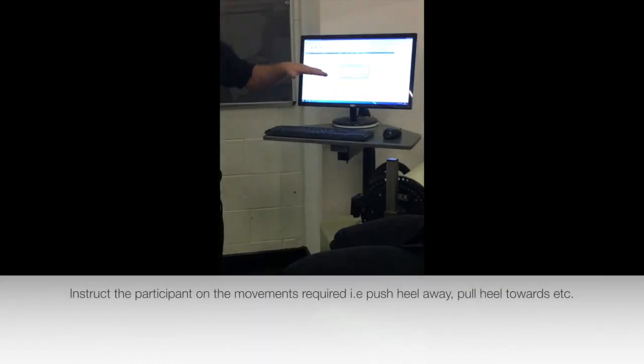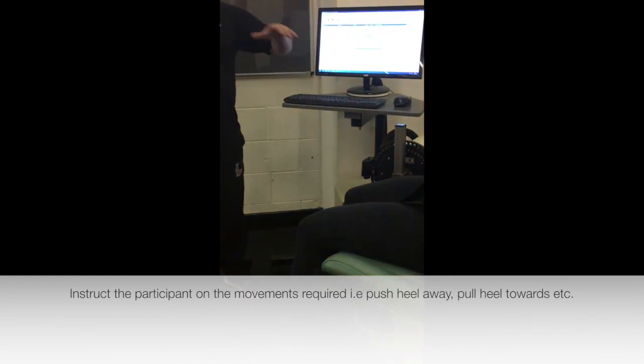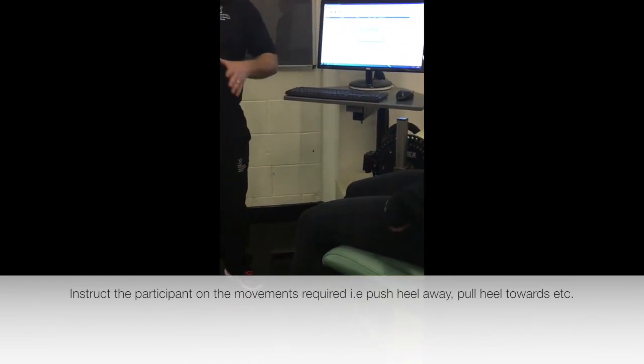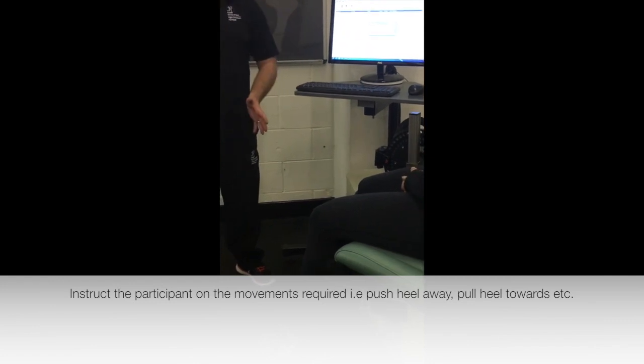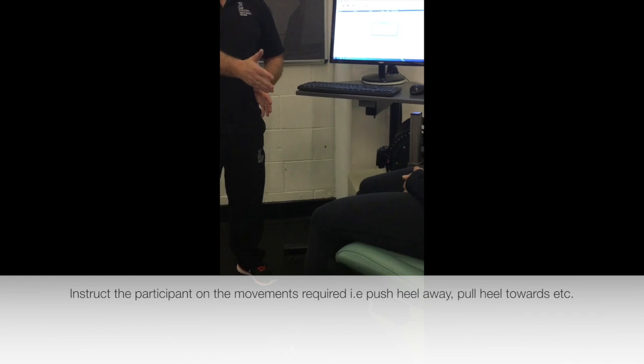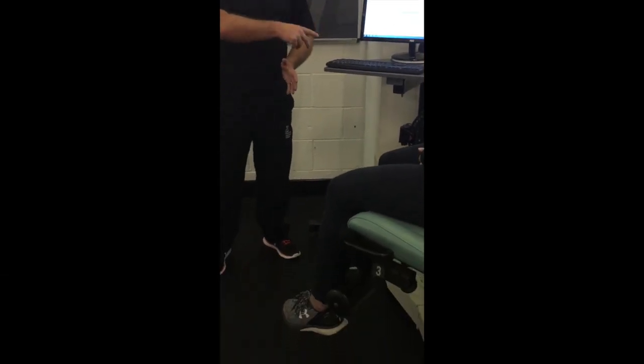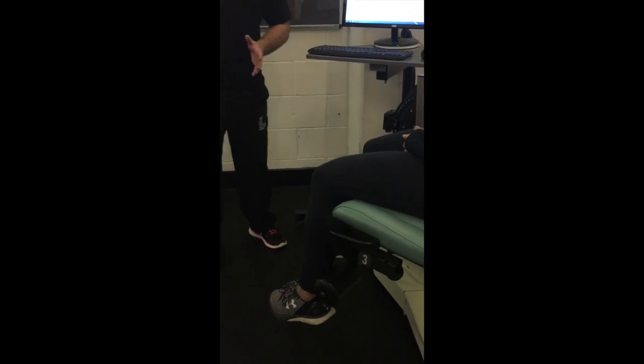So this is where you warn them that this is where the testing is about to start. So my advice is, while they're warming, when you get them in, set the machine up, send them away for their warm-up, and then literally sit them back on the machine, almost at this stage, ready to go, because then they don't cool down too much.